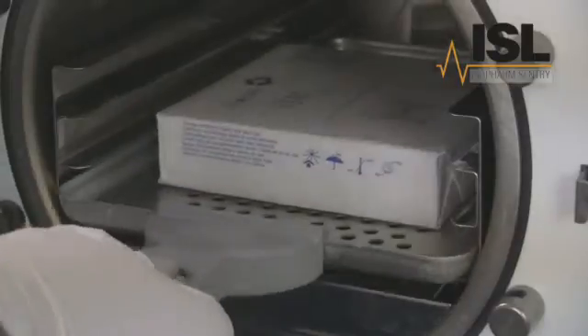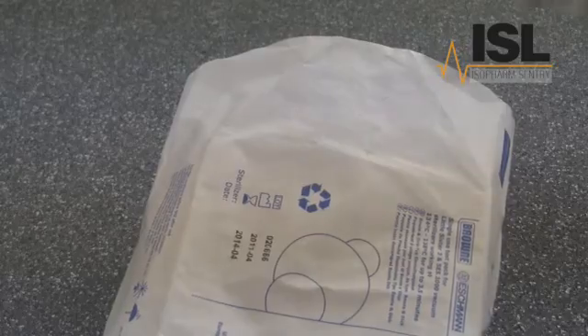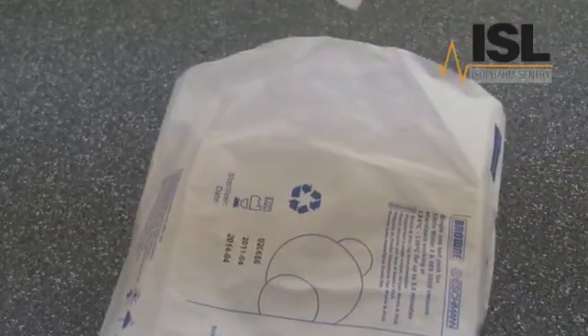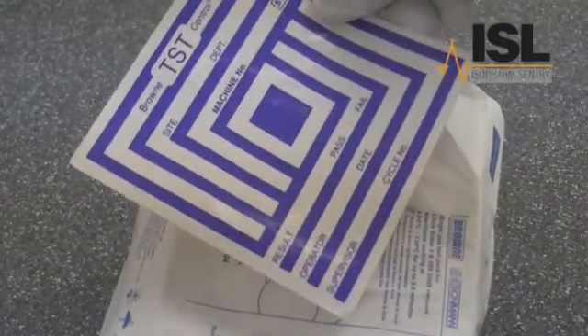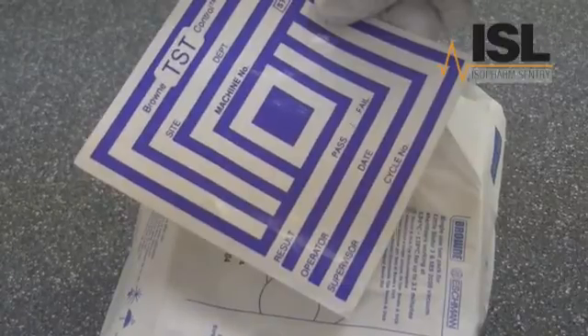Carefully remove the Bowie Dick Pack — remember that it will be hot. Unwrap the pack and remove the sensor sheet. In this example, the ink on the sheet has uniformly changed from yellow to blue. This proves that the cycle removed all the air from the sheets and pushed steam back in to contact the test strip. In this instance, the cycle has passed.